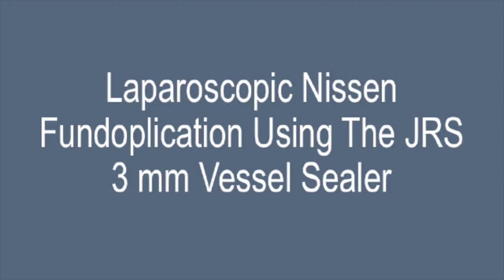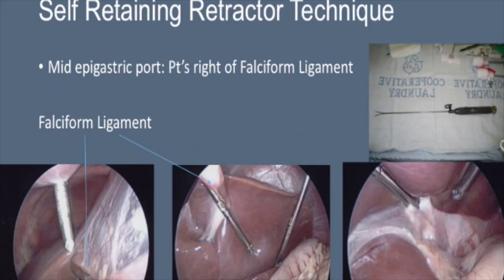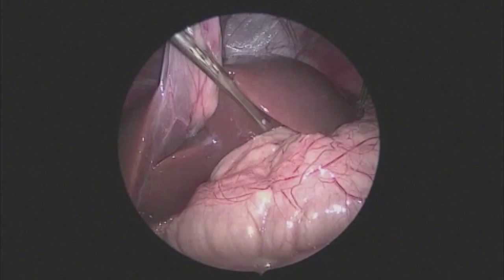This is an example of using a three millimeter vessel sealer to do a fundoplication. The port placement is as seen here. The retracting ports are in the upper abdomen. The mid-epigastric port is used to place a self-retaining retractor which goes around the falciform and can grab the diaphragm to hold the liver out of the way without the aid of another assistant.